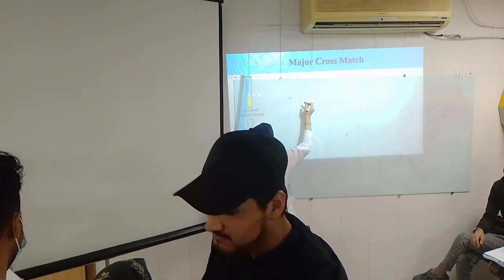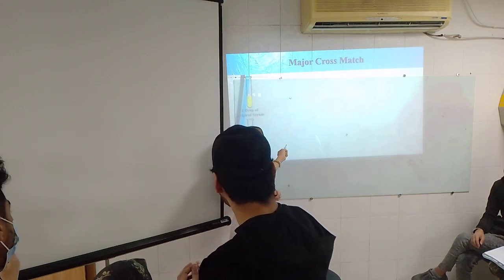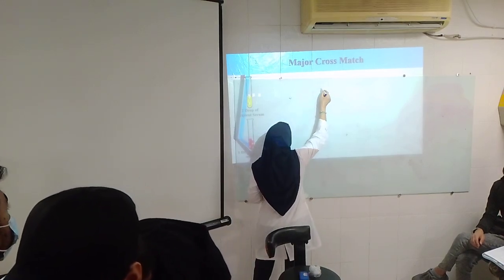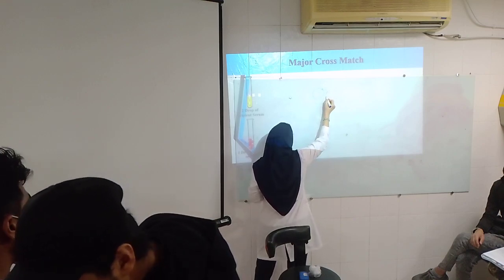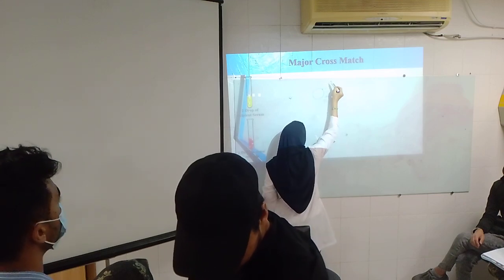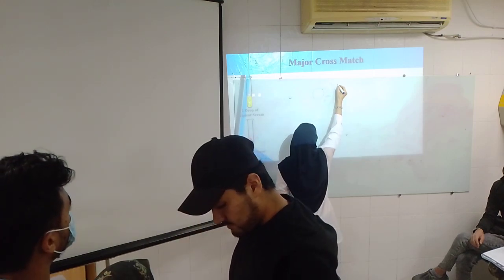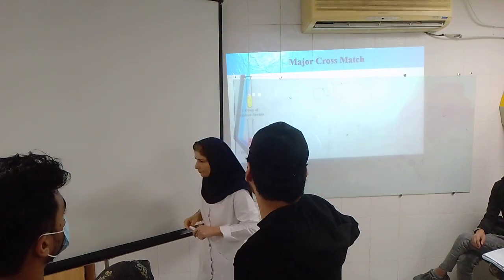You know, as I explained for you, we have some antigens and antibody naturally in our body. On the surface of RBC, we have maybe antigen A, B, both of them, none of them. In our plasma, maybe we have some expected antibody in front of that, something like anti-A, anti-B, both of them, none of them.